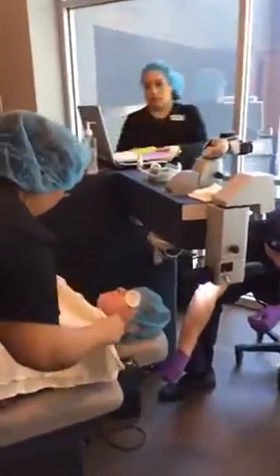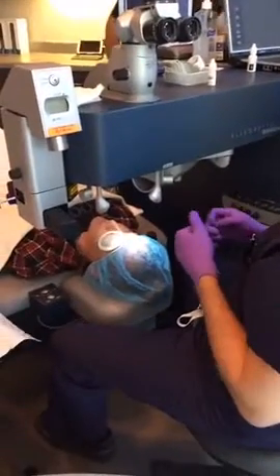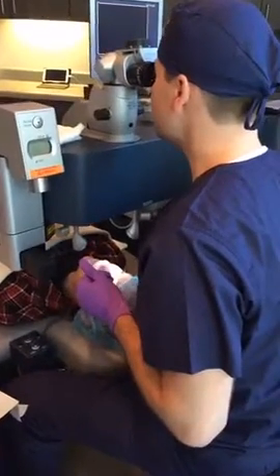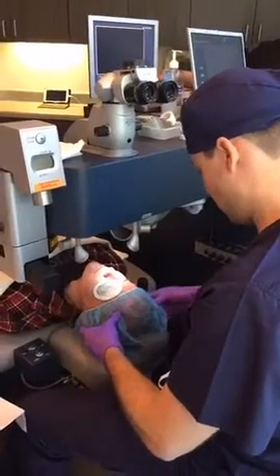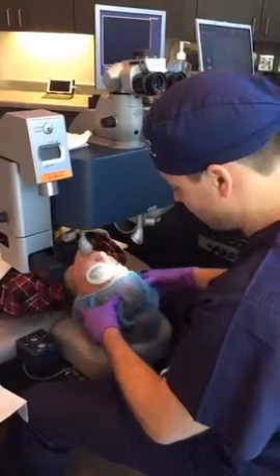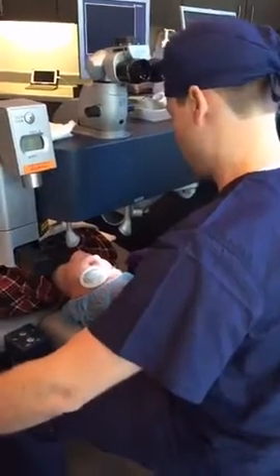Okay, Halee, so over here, similar kind of thing. You'll see some lights in front of you. And just like before, there's a green one blinking in the middle. There's also some red lights. You can kind of ignore those. Okay. And just look for the green one that's flashing. Do you feel like your head is kind of settled in that? No, it's my bun, I think. Yeah. Should I take it out? No, just scoot down like 1 inch and let's settle it. There you go. So we'll settle your head in that different kind of donut.